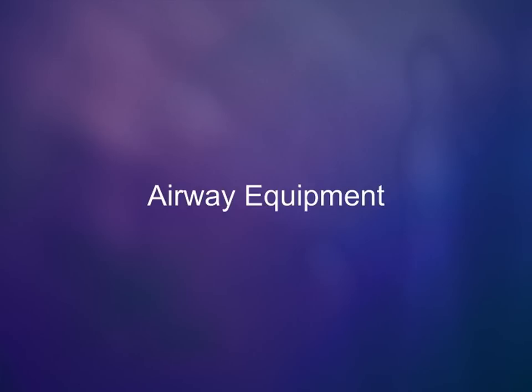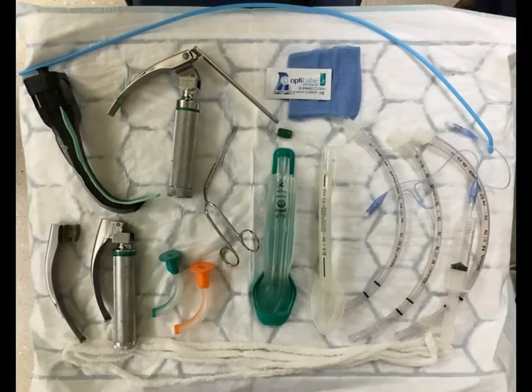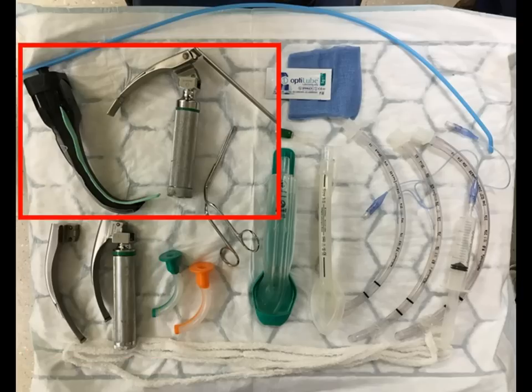The equipment required for the process of intubation should be available and will include a face mask with angle piece and filter, two working laryngoscopes of different sizes, such as a Mac size 3 and 4, with alternative blades available in the event of difficulty, such as a McCoy blade or a video laryngoscope, typically kept on the difficult intubation trolley available just outside the emergency theatre.